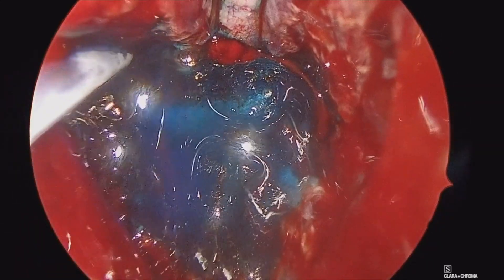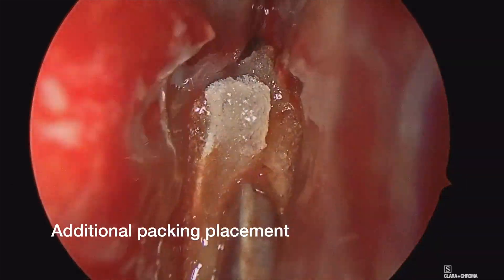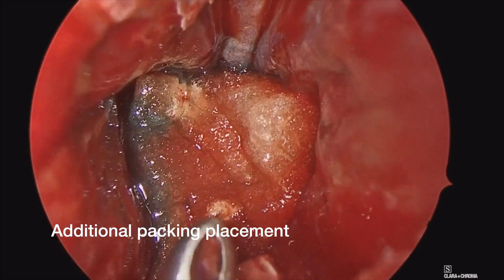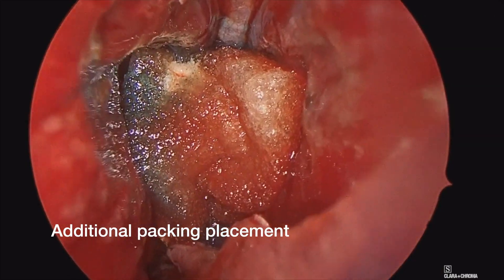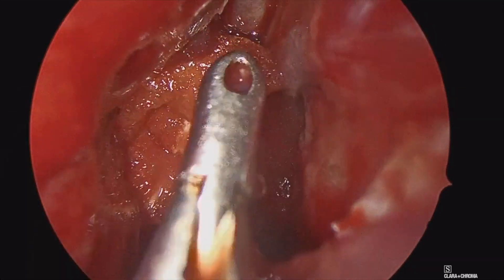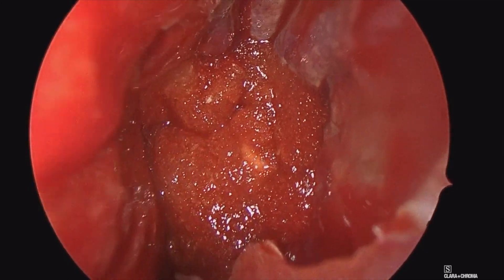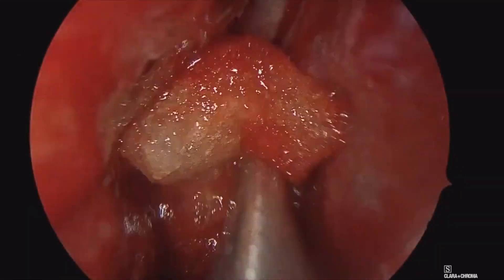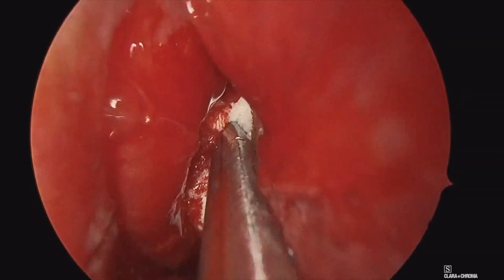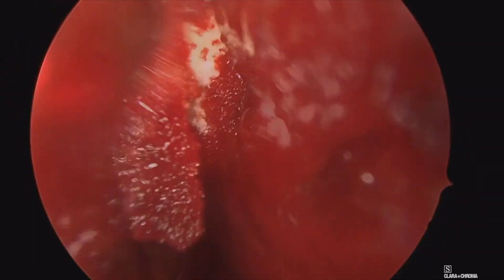Once that tissue glue is placed, I will put a single layer of gel foam over top of the glue. This allows me to have a barrier when I debride the patient between additional packing material, which will be debrided at the first visit, and gel foam, which I tend to leave in place at the first debridement to ensure I don't accidentally remove the graft itself. So there's gel foam going in, and then you'll see additional resorbable packing material, which I'll be able to debride at their post-operative visit.